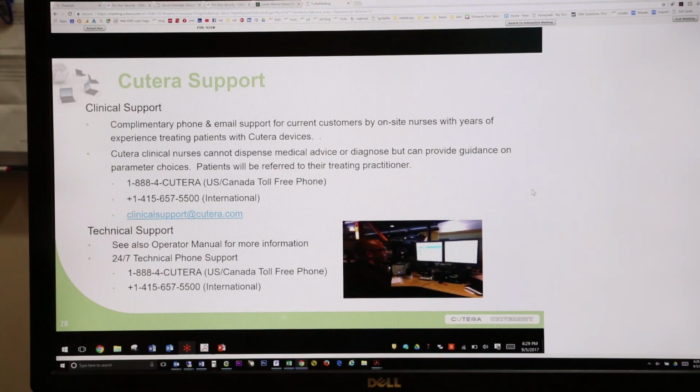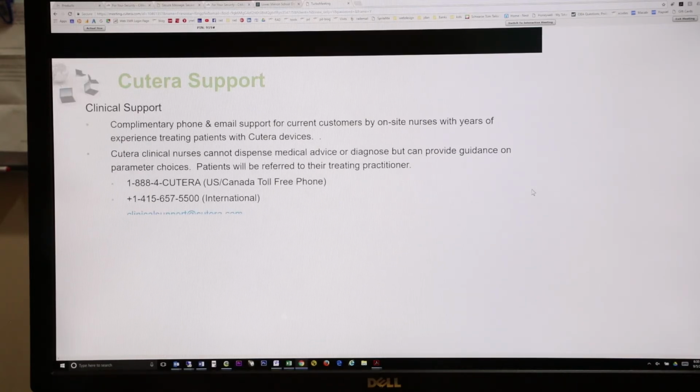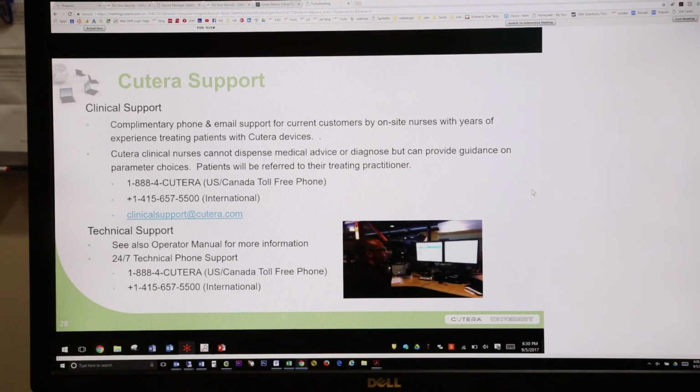And you do realize that there are certain tattoos that will also not clear if you are using 18 or 19 or 20 treatments with a picosecond laser. And you might say, well, maybe this person would have been better off altogether having started with a Q-switch technology rather than the picosecond technology. So these are things that you're going to learn over many years of tattoo removal, not necessarily after 1 year when you're still in the mode of treating every 6 to 8 weeks only because the company says so.